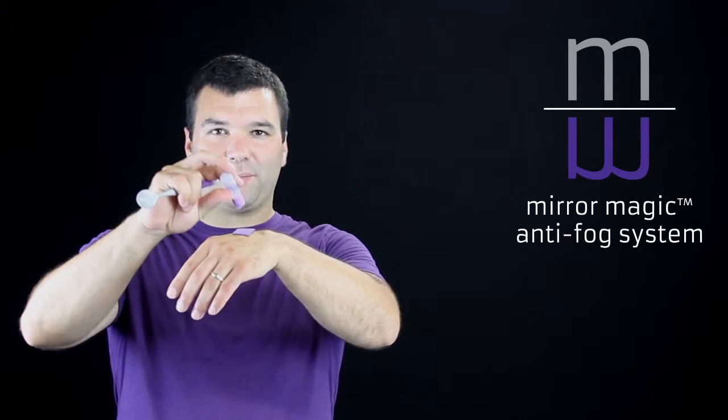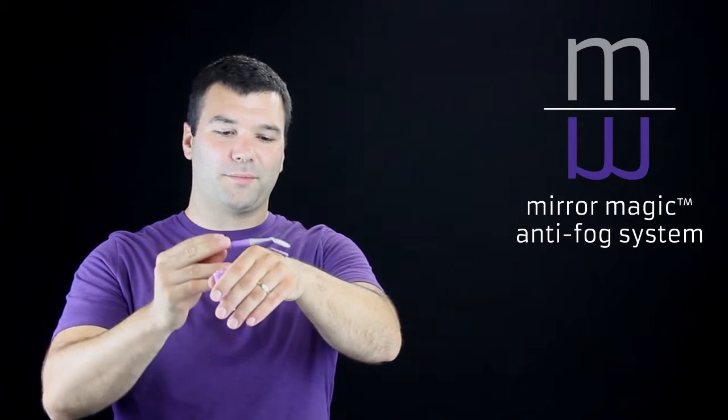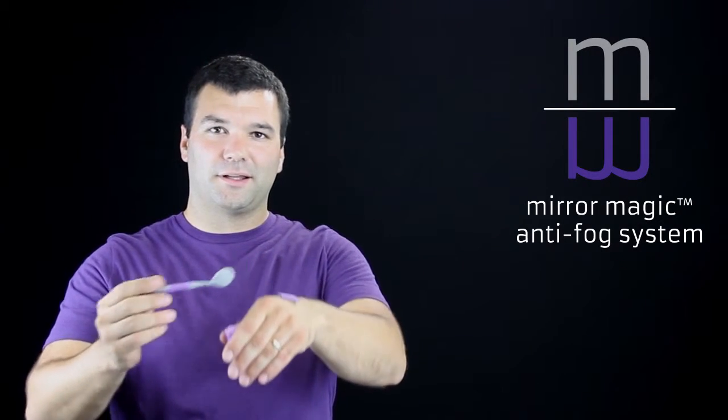Show the dental office, and now take the solution, add three drops to your swipe pad, and gently swipe the mouth mirror across the pad. Now you can blow on it again and show the office that the mirror does not fog.